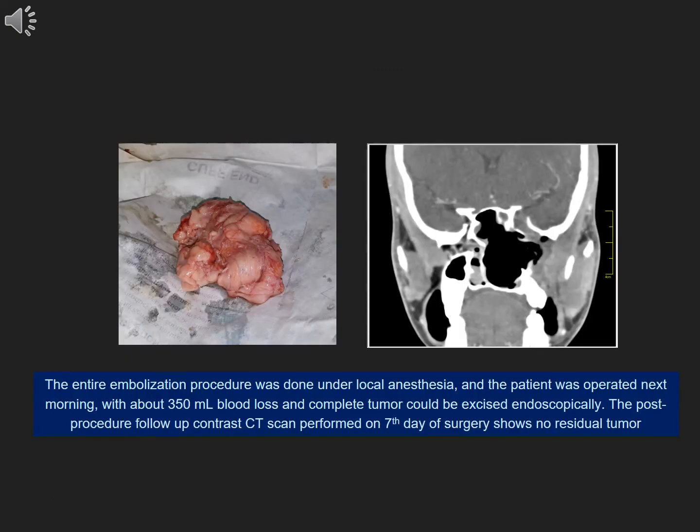The entire embolization procedure was done under local anesthesia, and the patient was operated the next morning with about 350 ml blood loss, and the complete tumor could be excised endoscopically. The post-procedure follow-up contrast CT scan performed on the seventh day of surgery shows no residual tumor.